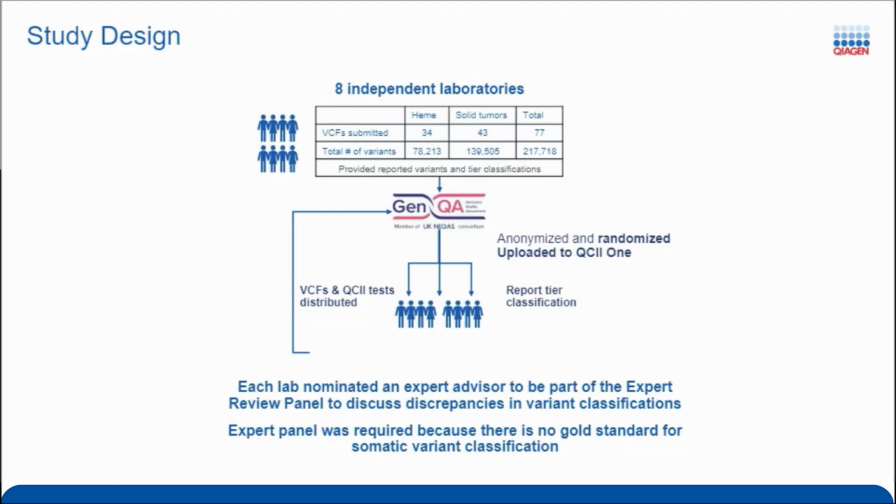Yeah, I think there's judgment that has to be applied on every level. We made a decision about setting all of the cutoffs to be equal across all the labs so that we would have a standard. But as Jim mentioned, if you're doing it in your own lab, there are going to be differences in how you set the filters, whether you lock them down forever or whether you adjust them, usually not on a case-by-case basis.